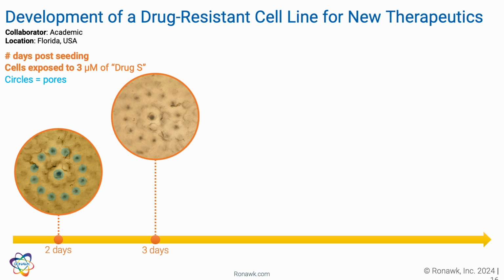And as just an anatomy of our block, here is the center pore. That pore goes top to bottom, and it's the only pore that goes top to bottom, while you can see the other pores surrounding that one, and those will be like little stairs inside of the block. You can get to different levels of the block.